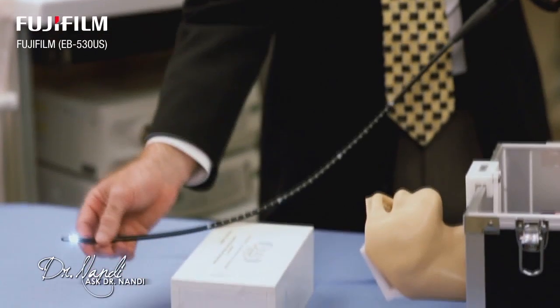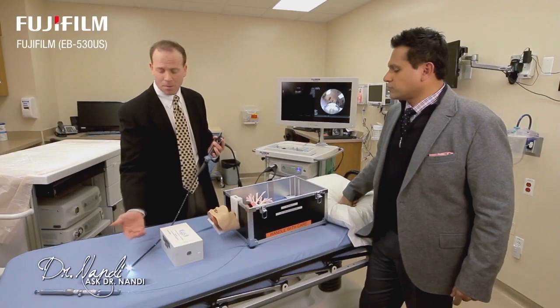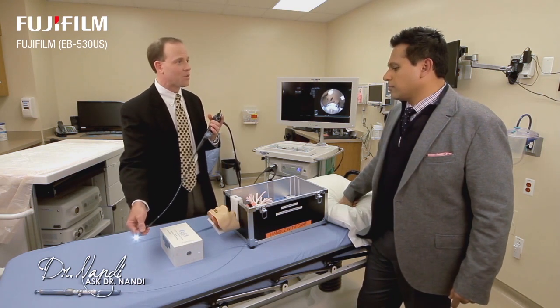That's pretty cool. And then just beyond that is the ultrasound probe, which extends beyond the camera, but with this scope, what's very nice is that you can actually see what's in front of you, and you can see the tip of the ultrasound and where it's going.